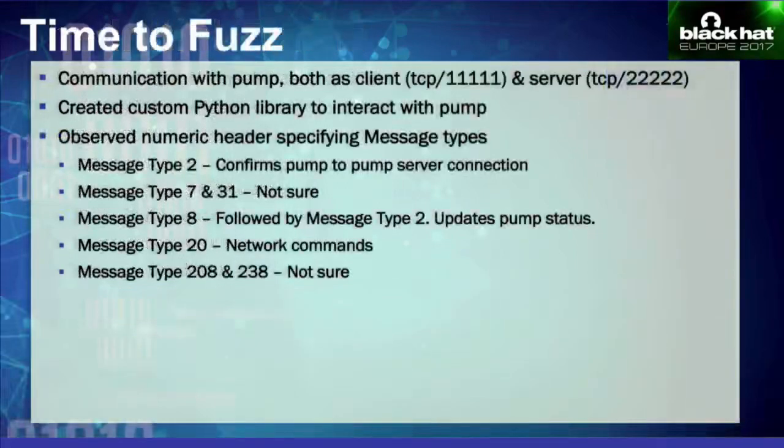Right, so after going back and forth, we tried to understand the request format and what the format of the response would be. Remember, we didn't have an actual pump server on our network, so we didn't really know what the request and response would look like. So we started to write Python code, because it's always easy to automate stuff and try out different input and output. We did a lot of back and forth, but after a while we started to understand the format of the packets coming in and the kind of response it was expecting.